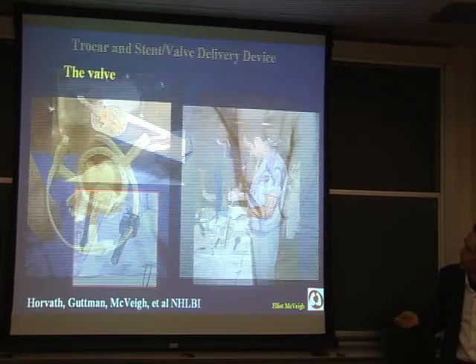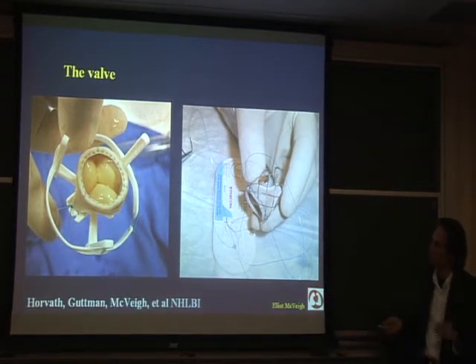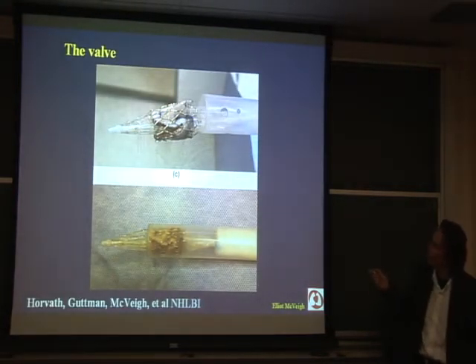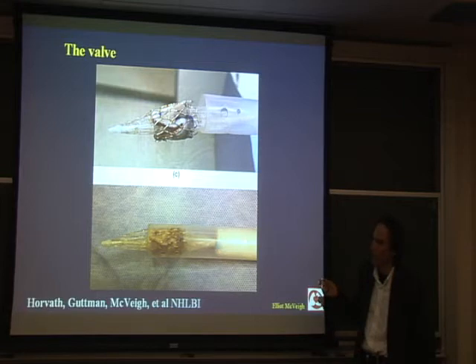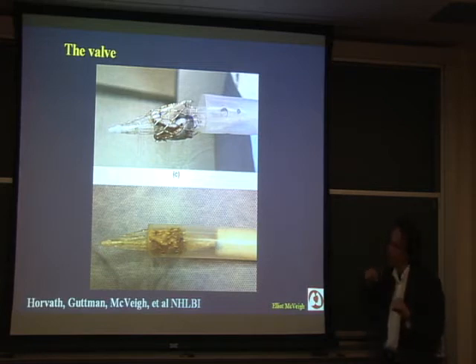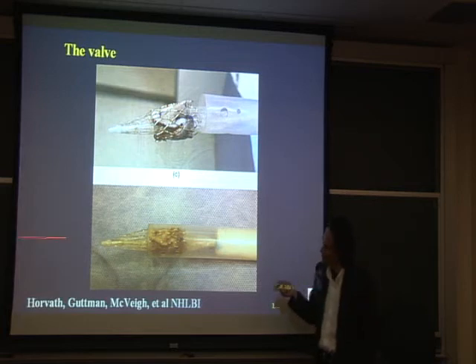I think I have pictures of the valve. So here's the valve. It just comes out of the jar, the SPV valve right off the shelf. It has a platinum-iridium stent, and he goes to the outside of the valve and crimps it down onto a balloon catheter. Once it's all crimped down, it's pushed back into our high-tech introducer, which is a plastic tube. Inside the plastic tube, we have a stiff nylon rod, with a hole in the center for the balloon, and you can manipulate both the rotational angle of the valve and push it back.